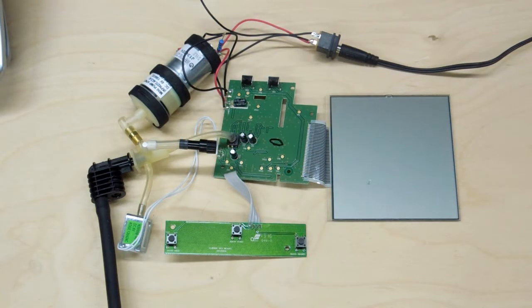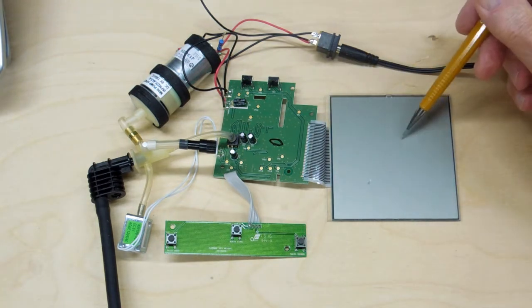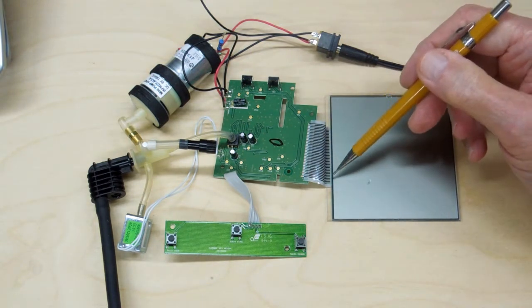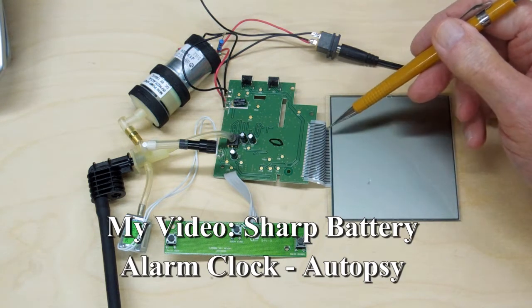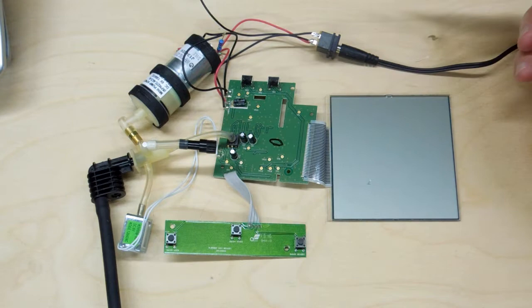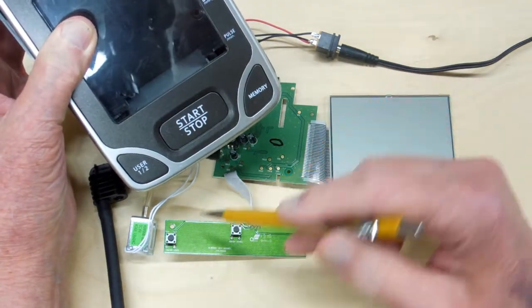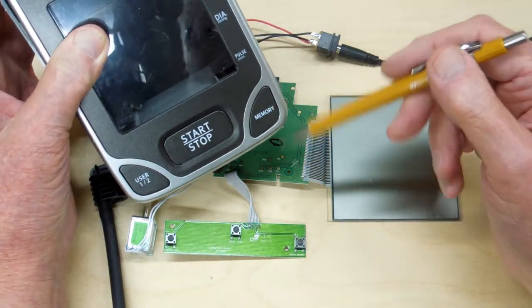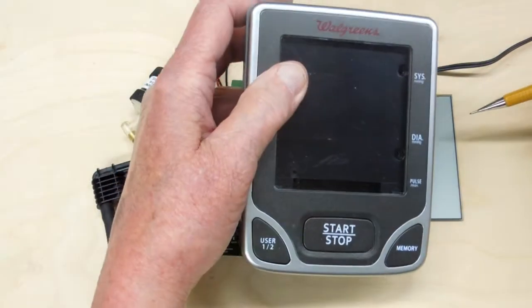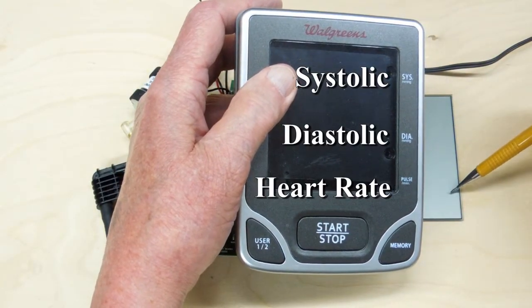This is basically what will be in your blood pressure monitor. You've got a circuit board and a display. This ribbon cable — just like that clock that fell apart — the connections are just glued on there, there's no solder connection. These are your control buttons: start and stop, switching between user one and two, and memory. On the display we're going to have systolic, diastolic, and pulse.